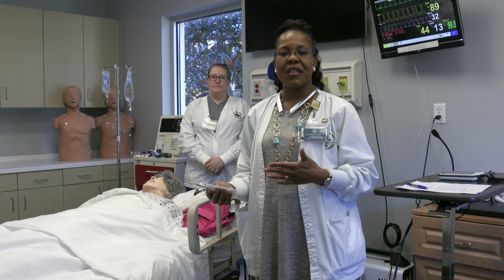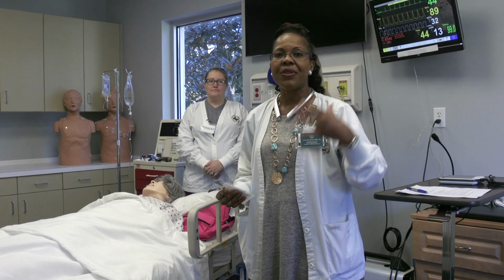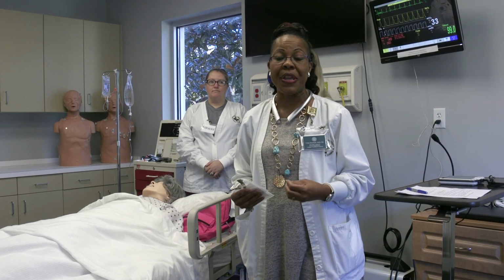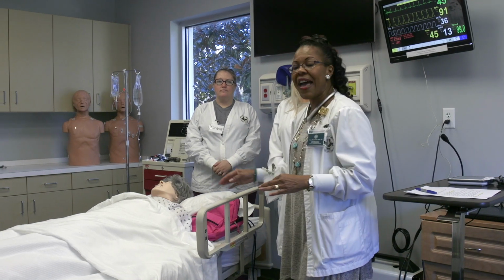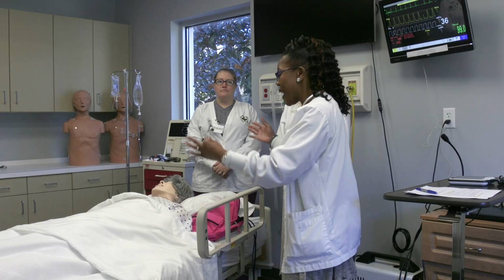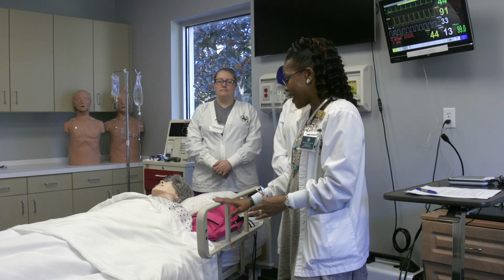When you come to the STAR Center to practice for megacode, you want to make sure that you follow through on coming during the time that your instructor will have scheduled for you. When you come into the clinical setting here in the STAR Center, you're going to find that the bed may be up or down, so I want to show you how to use the equipment.